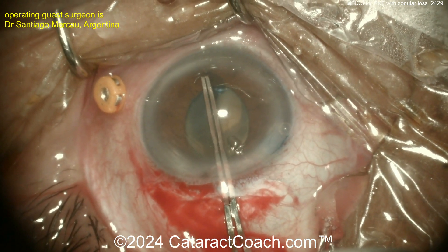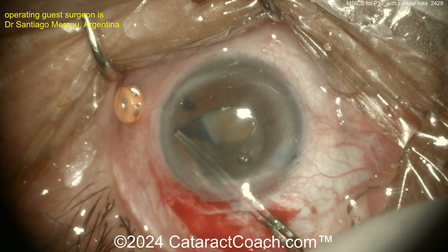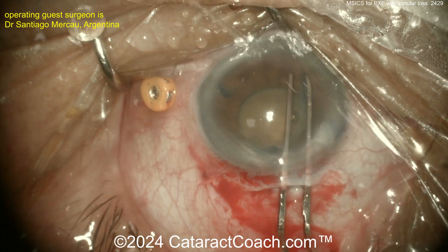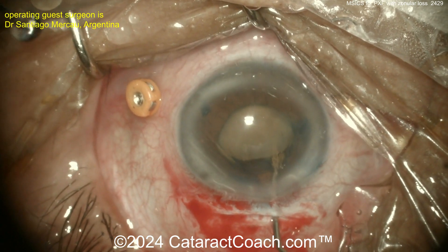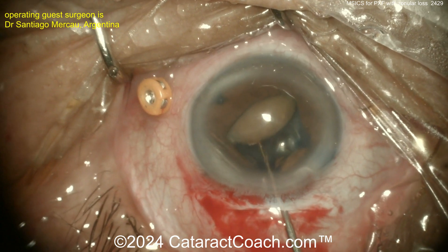The surgeon gets a nice big rhexis — that's important, a generous rhexis. In some of these pseudoexfoliation cases the zonulopathy can be really quite severe. Now getting the nucleus up and getting it out of the capsular bag — there's a nice dense nucleus, you can see how opaque it is.